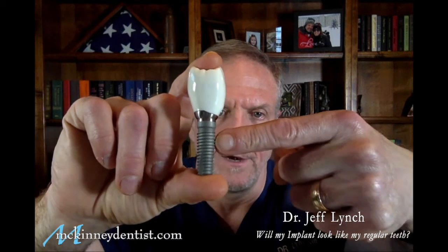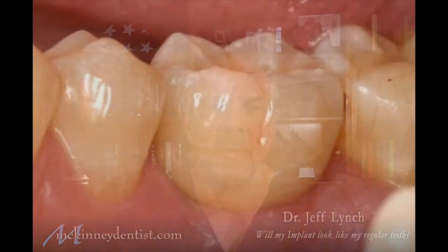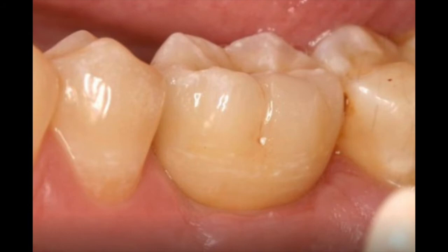Well, the dental implant itself is the titanium screw, onto which we're going to build the porcelain crown. So in order to look just like the regular teeth, we've got to have a lot of things happening here. Look at this example of a molar implant. The implant is down under the gum and the bone, and the crown on top of it makes it look just like everything else.